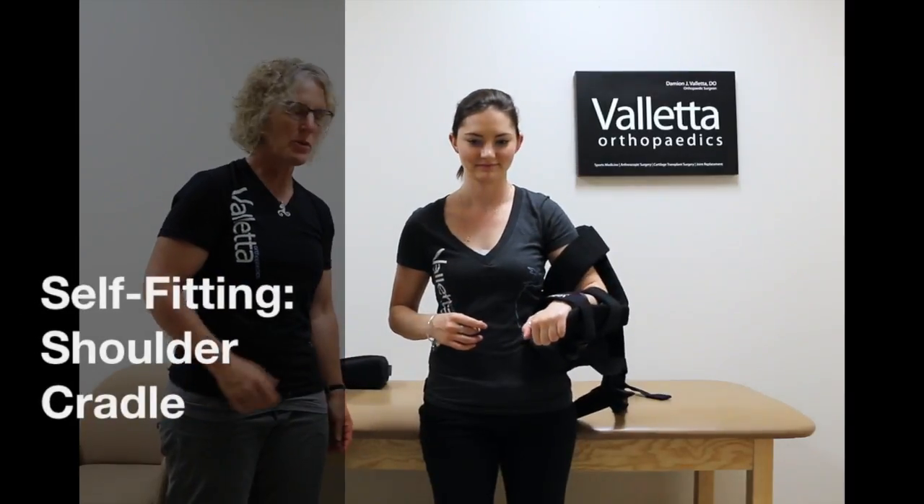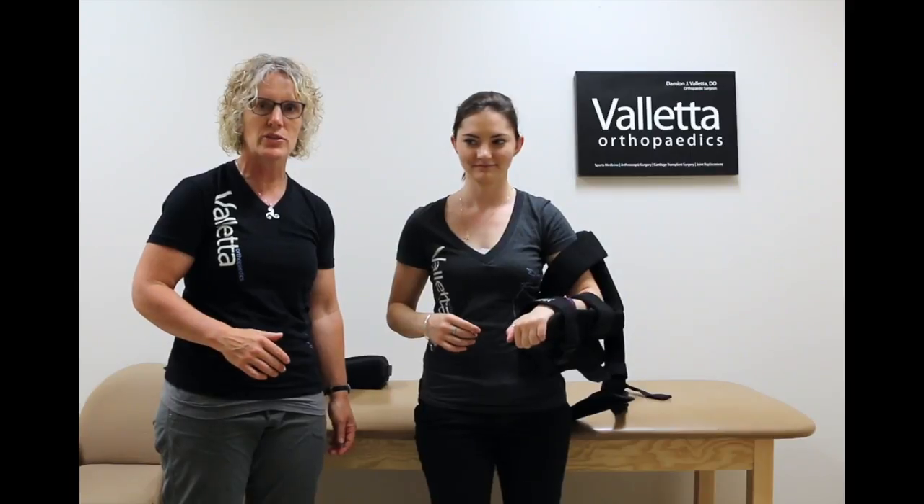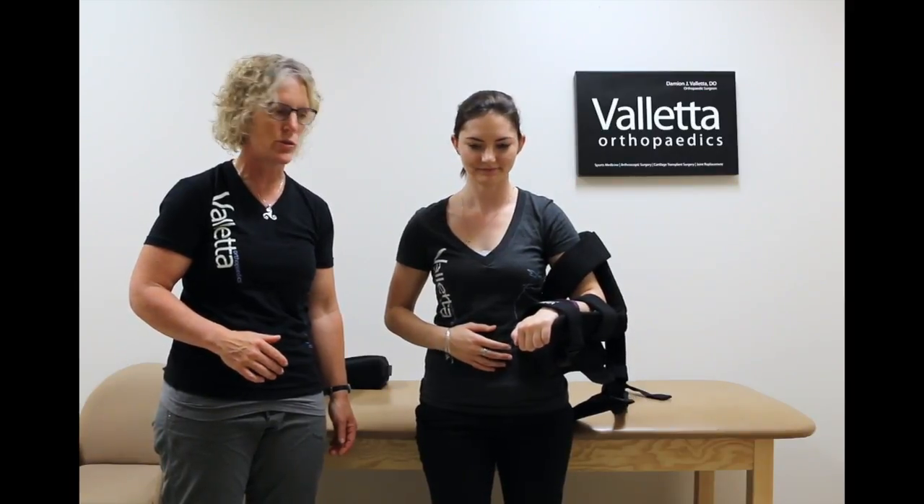Now that we've learned how to put the brace on, we've learned how to do the passive range of motion exercises to keep mobility in your shoulder.